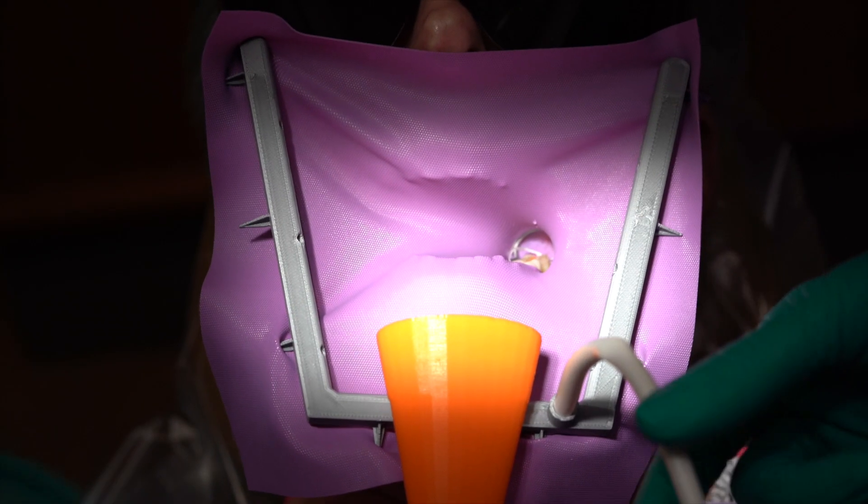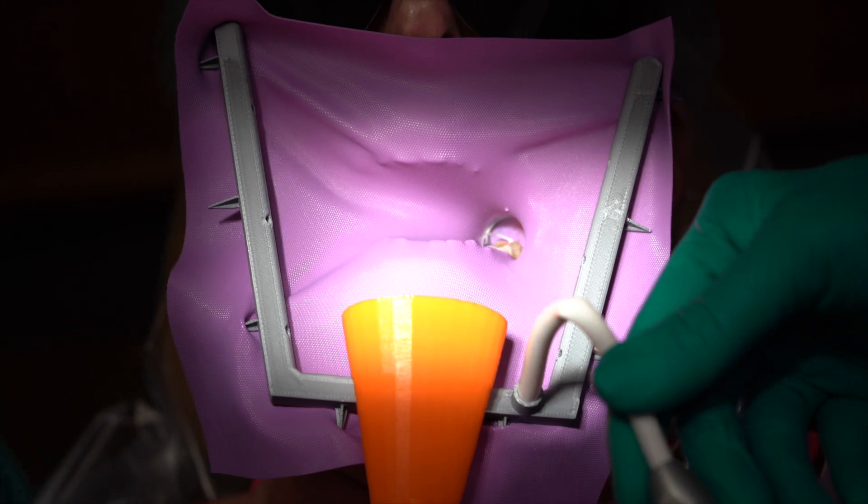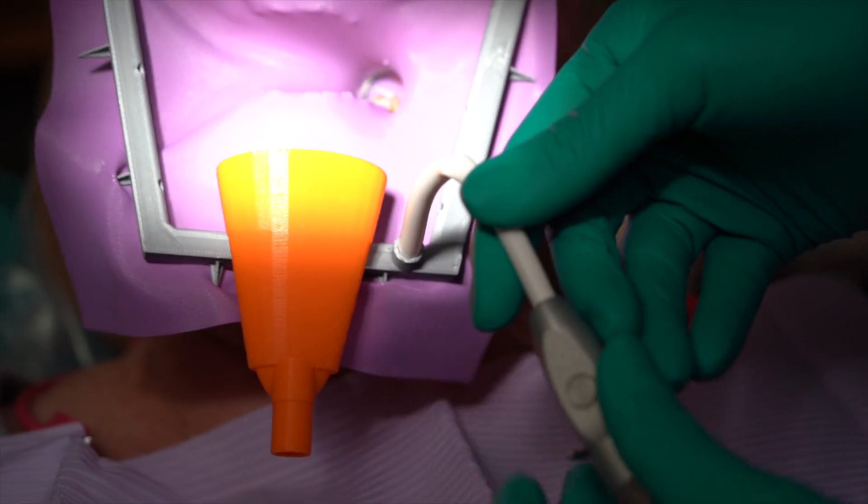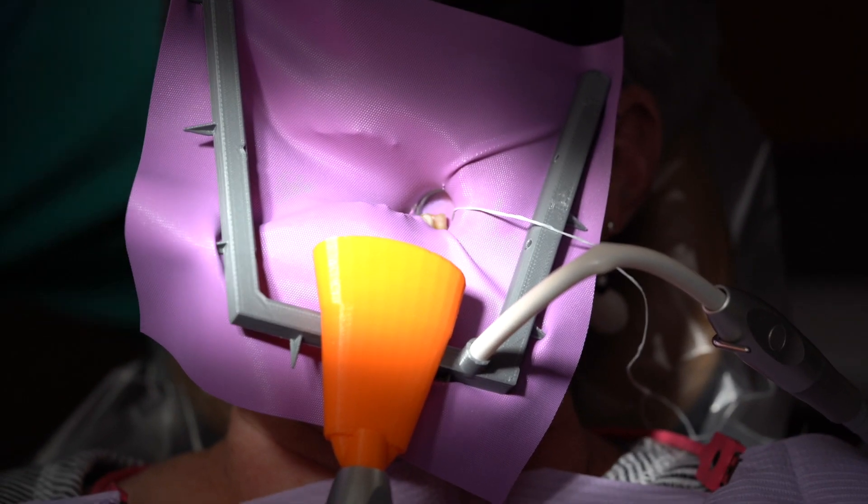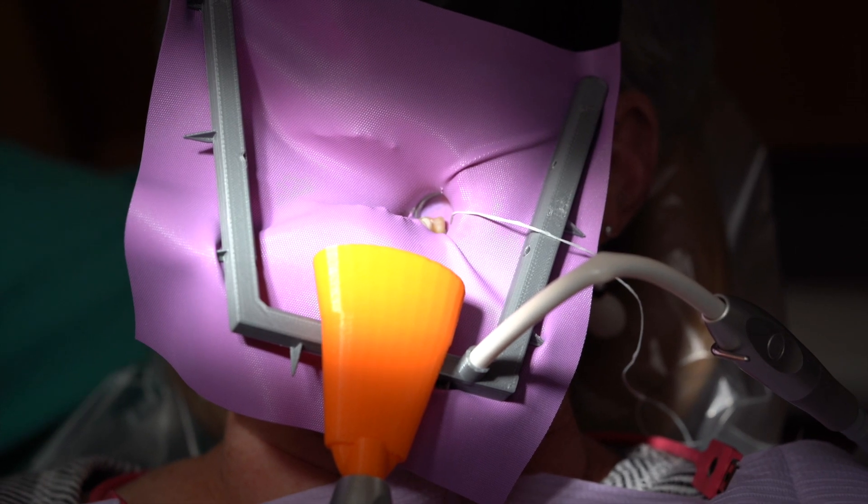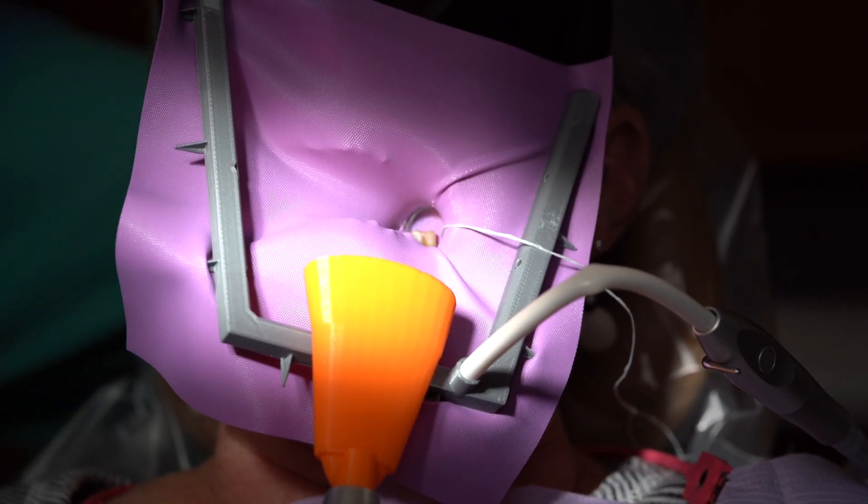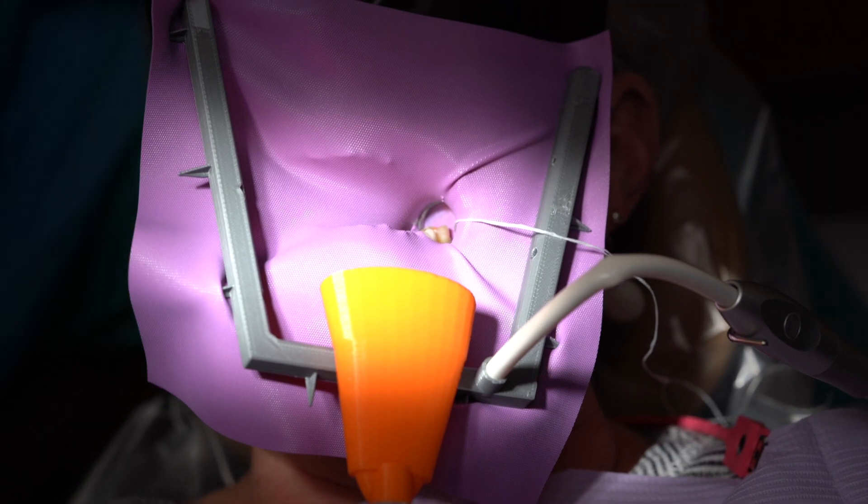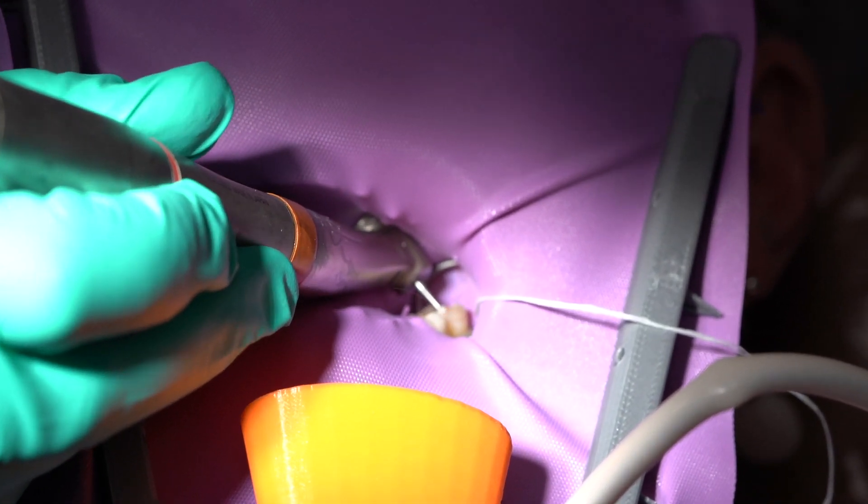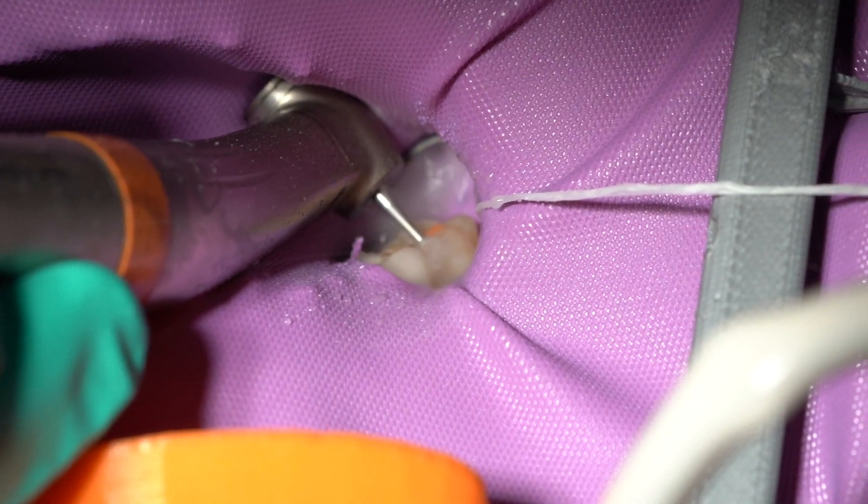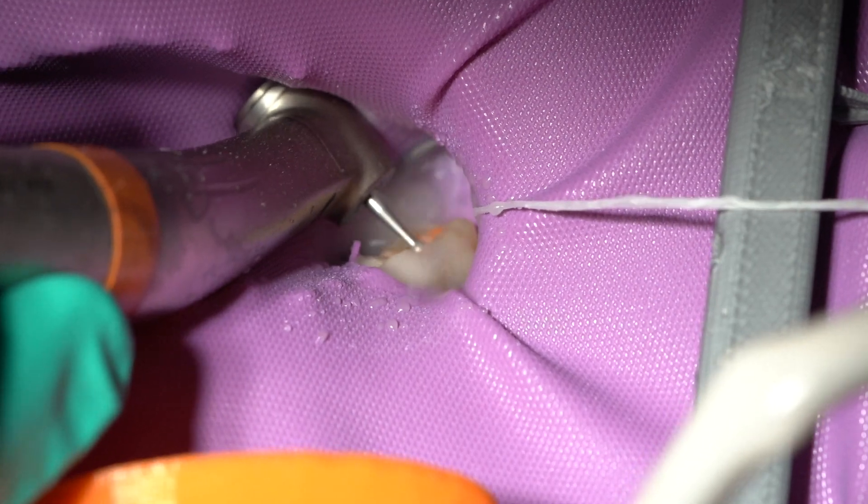Now, here we go. Clinically, we have attached the rubber dam to the 3D printed frame. We've now attached and turned on our suction unit so we could get that full effect there. And we are going to lastly attach the high volume evacuation. So we've done that. And you can see the whole thing in utilization here. We don't even have the whole entire framing gauge, but you could see just how powerful this thing is. And it's just remarkable how much this thing captures. And it's going to be really something that I think is going to be great, especially if you combine it with a really good assistant.